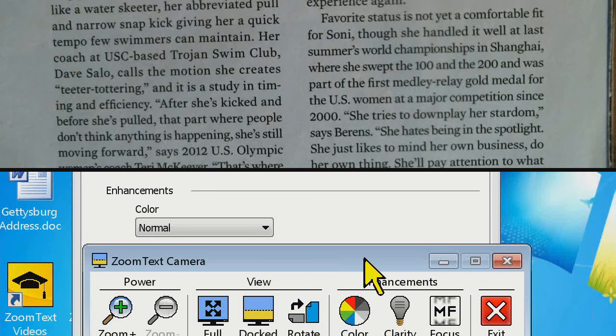When you're doing stuff over the internet, it depends on our speed here and your speed where you are, and it could make it look a bit distorted. So just wanted to throw that in. Yeah, that's a very good comment. It might be hard to tell the difference here, but just take our word for it. Increasing frames per second is going to make a world of difference.